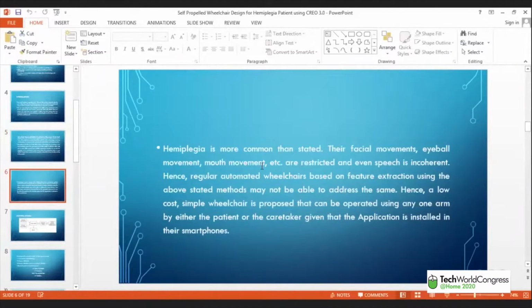Okay, so we don't want to make the system unnecessarily complex by providing so many options. Remember, it was a one-to-one kind of setup where someone wanted to address the needs of a specific person and maybe later on extend it to the entire community, such that the wheelchair can be used in household and nearby locations, right? Not for all outdoor applications.